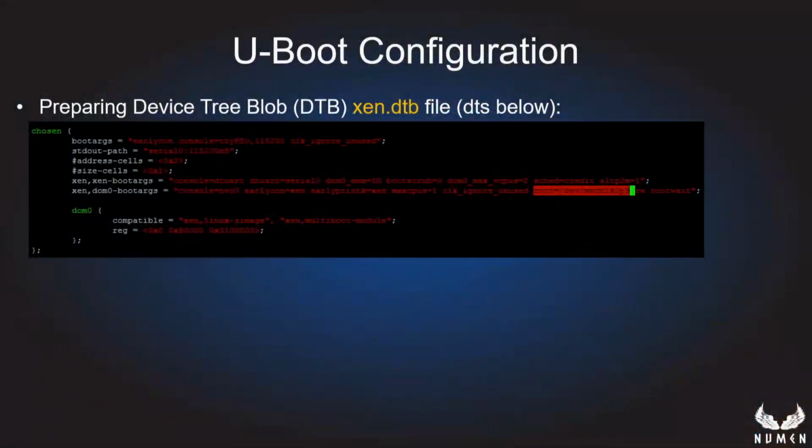So we had a lot of pain trying to play with different versions, and it was not booting. Once you reach this initial stage of JTAG, you get into the U-boot prompt, and now let's boot the board. The first thing is the device tree blob, where all the configuration of the board is located. Then the root location: where is the root FS that you want to boot on? In our case, it's an SD card partition, as you can see there.